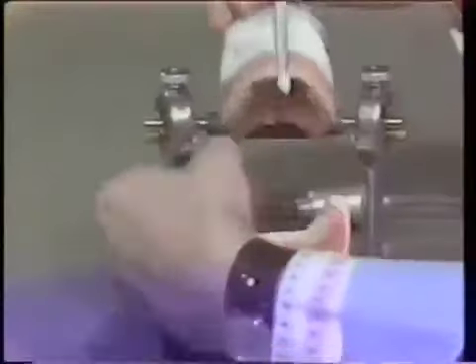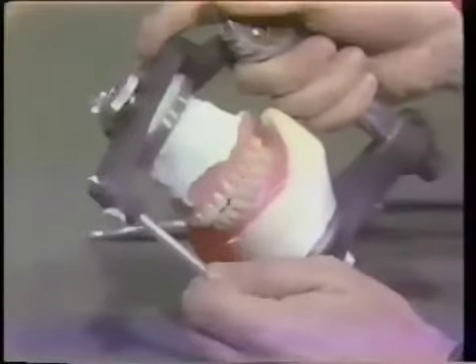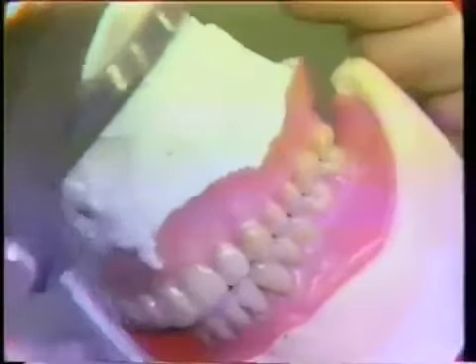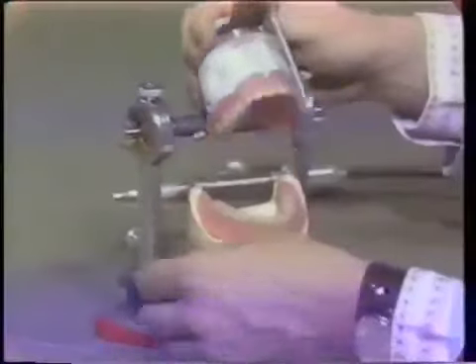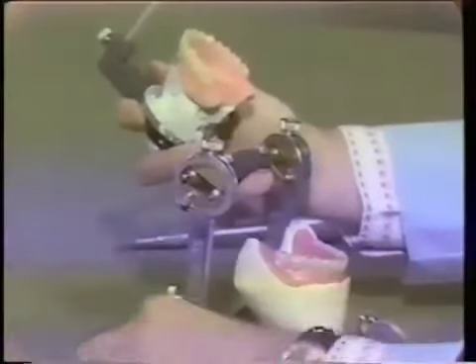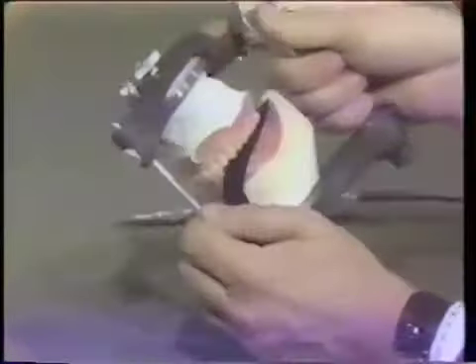Let's go over to the balancing side. If you have an interference on the balancing side, it will probably be on the second molar because of the configuration of these particular teeth. We can see interferences here, and the trick is to find out which interferences cause which problems. We're getting interferences on the cuspid — that is definitely solid contact in working — because that didn't touch in centric occlusion. The marks on the ridges of the cusps are starting to show here, contacting as the teeth come through in working. It's not a bad idea to use different colored paper for different excursions so you don't get confused as to which marks were caused by which excursion.